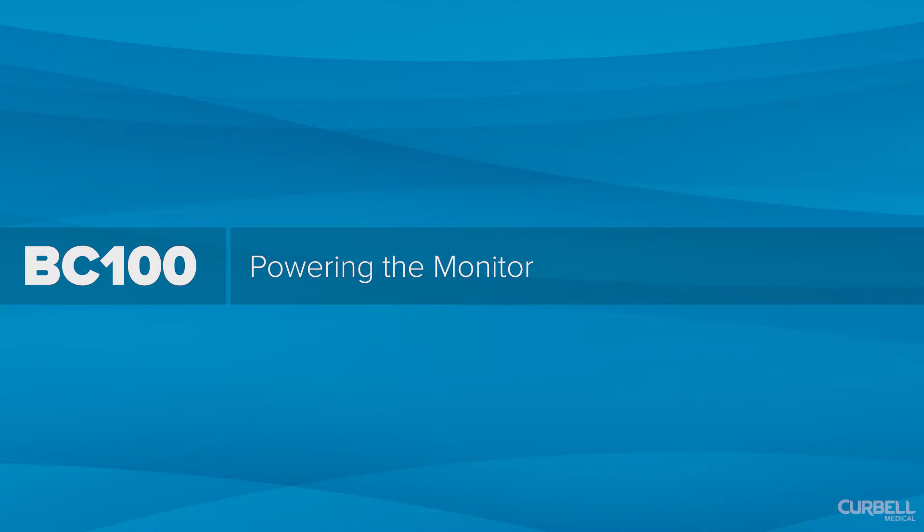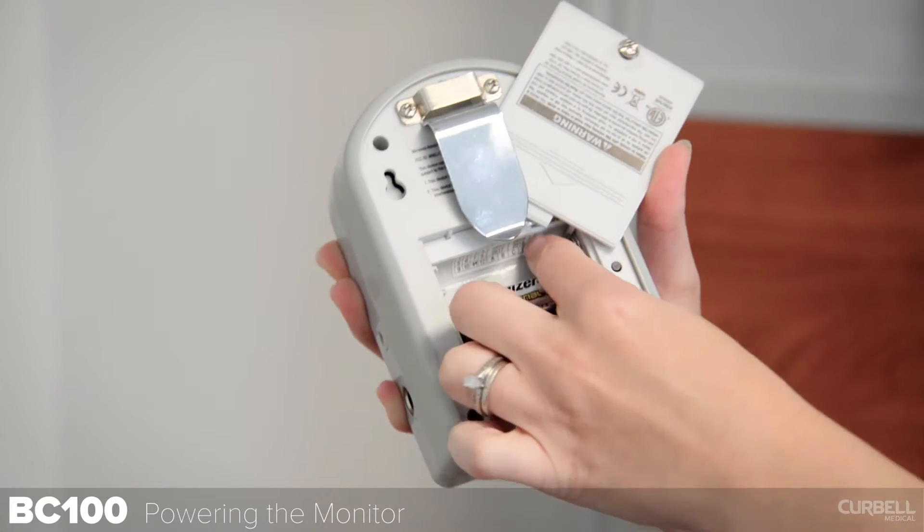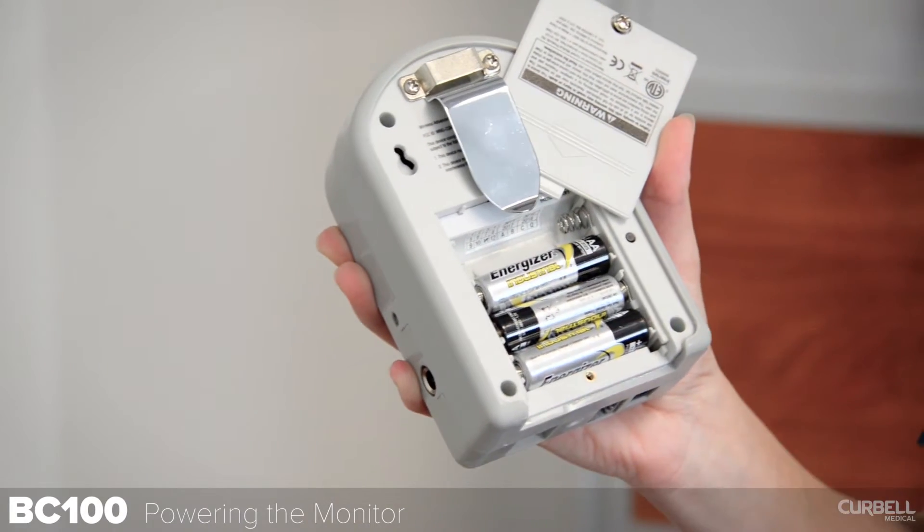Powering the monitor. The monitor is battery-powered and installation of four double-A alkaline batteries is required.